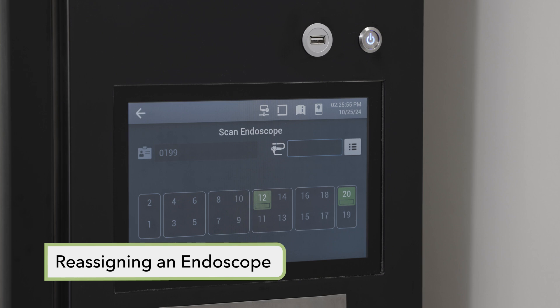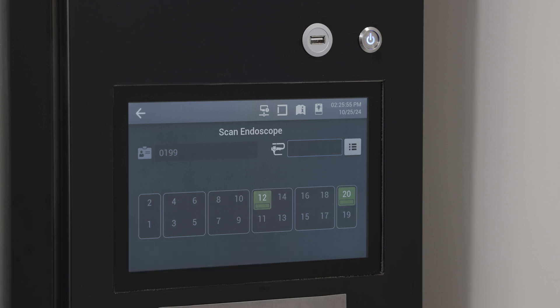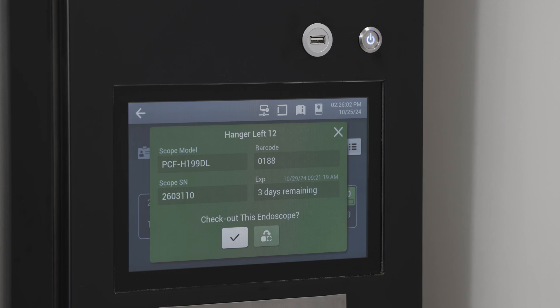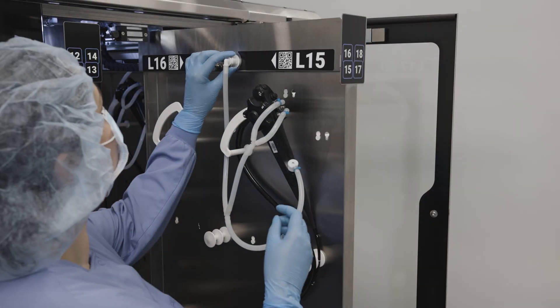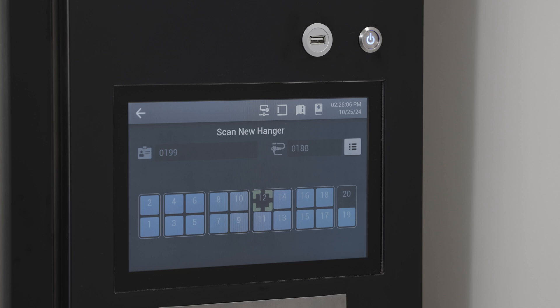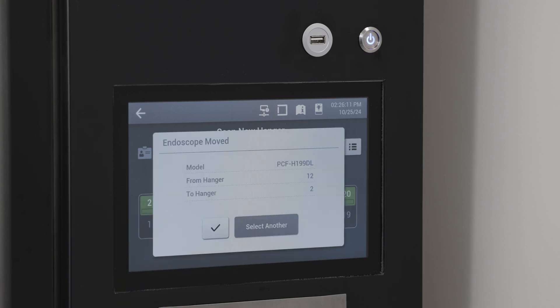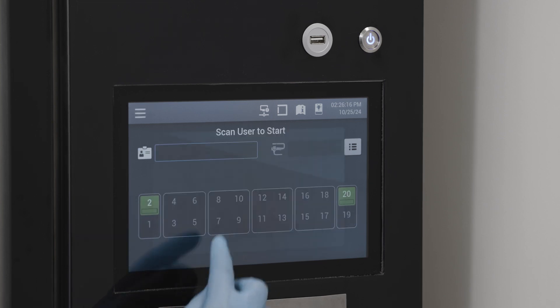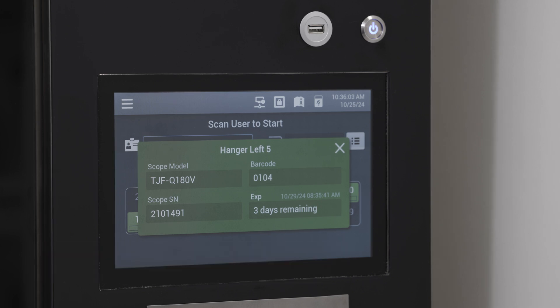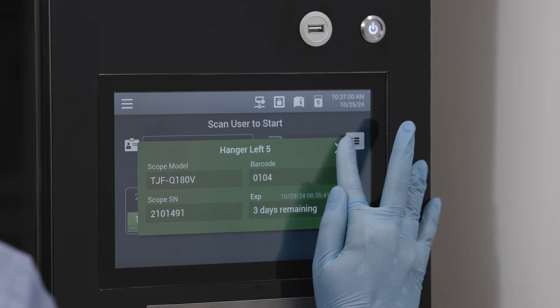If required, it is possible to reassign an endoscope from one hanger location to another. Access the cabinet by entering the user ID. Select the current hanger location on the screen and a dialog box will be displayed. Select the move endoscope icon, open the cabinet door, slide the applicable storage panel out, and disconnect the tube set from the manifold. Move the endoscope to the new hanger, connect the tube set, return the storage panel, and close the cabinet door. Select the new hanger on the display and a dialog box will confirm the endoscope was successfully moved. To check an endoscope storage time status, select a highlighted hanger on the main screen; a dialog box will show the hanger number and location, endoscope ID and serial number, days to expiration, and expiration date and time. Press the virtual exit button to close the dialog box.